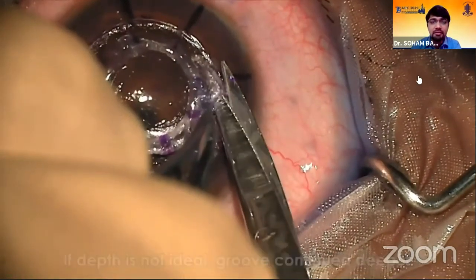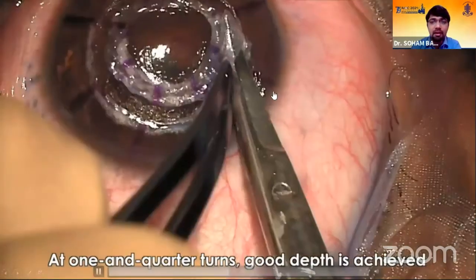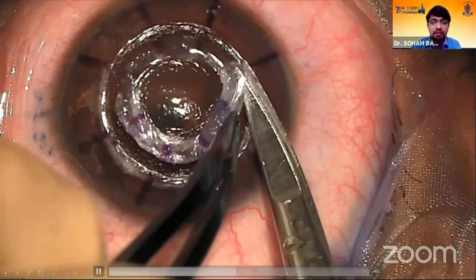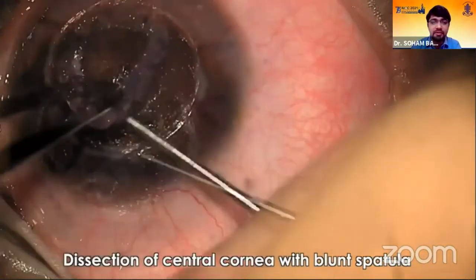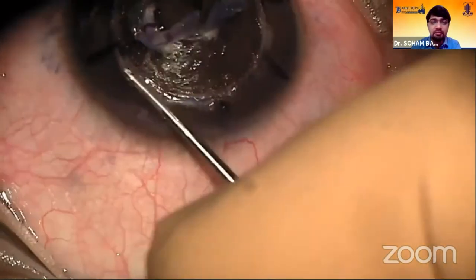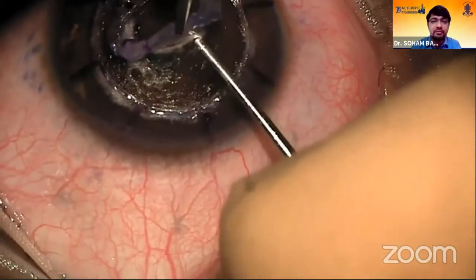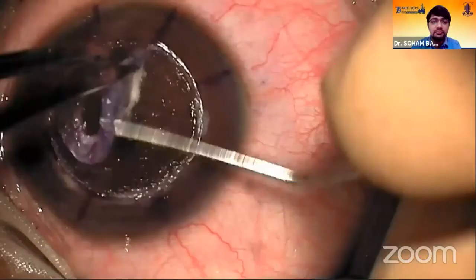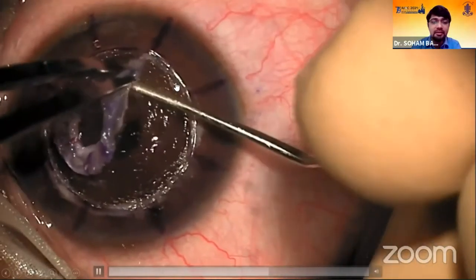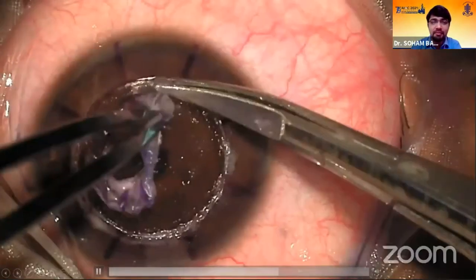So here we have gone one round and we are continuing the groove after the first round. And once the good depth is achieved, remove the central part using blunt dissection with the iris spatula. So look at this. You're stretching the stromal fibers and you're just gently disinserting those fibers from the underlying bed.